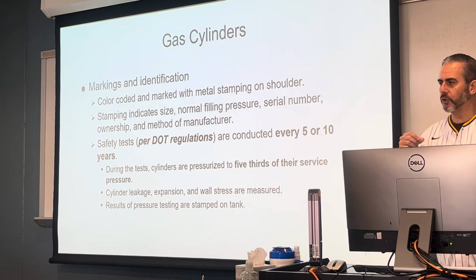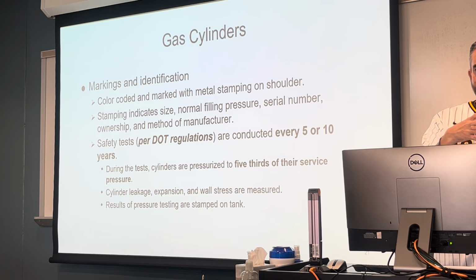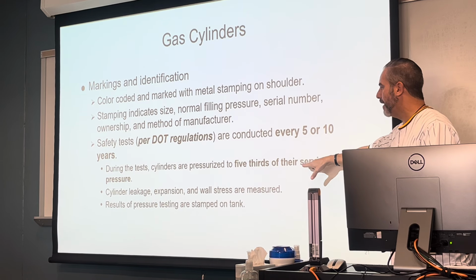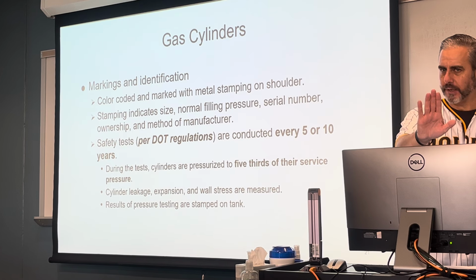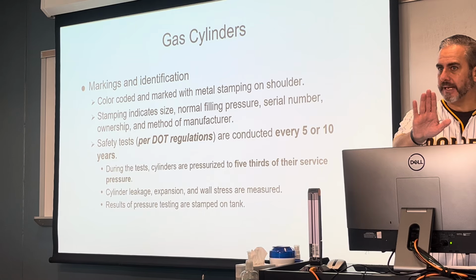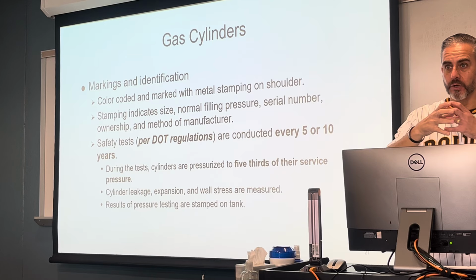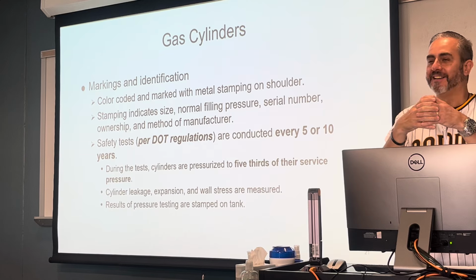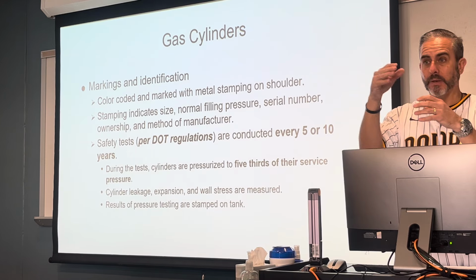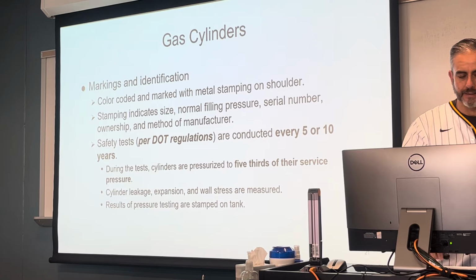So, to ensure that the steel alloy that is securing this compressed gas holds, during testing they test it to 5/3 of its service pressure. So there's a service pressure number, and they actually test it at a much higher pressure, 5/3 of normal pressure, to ensure the tank's integrity. Once it survives that testing, then we know it's good, and when we put less pressure in there, that tank will hold and not rupture or tear.